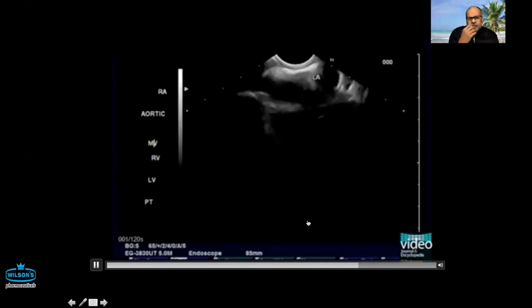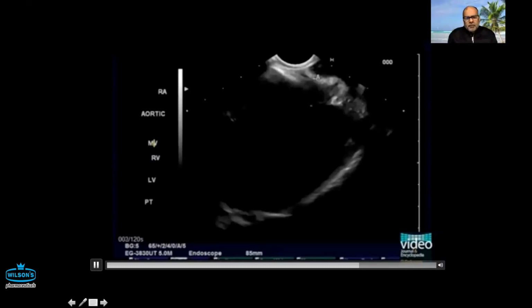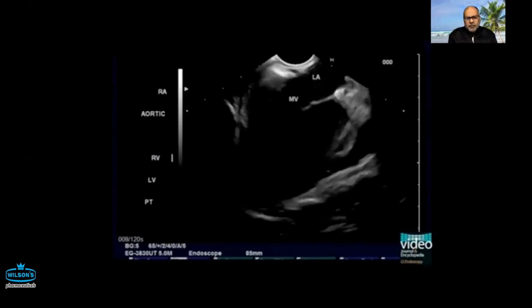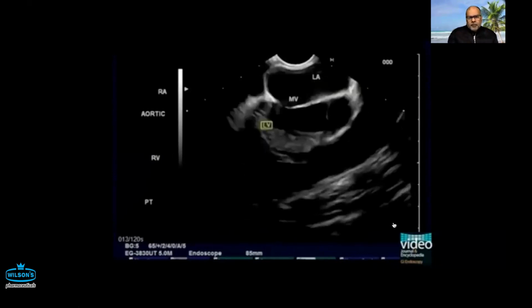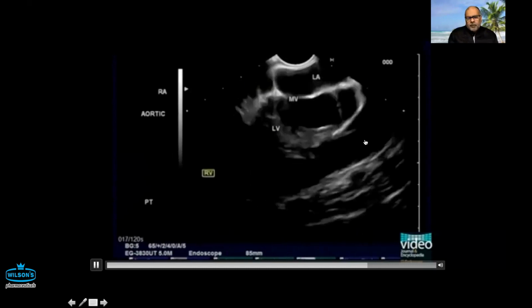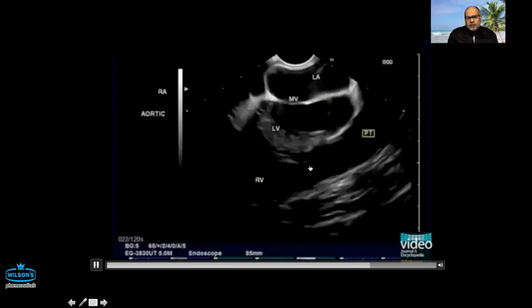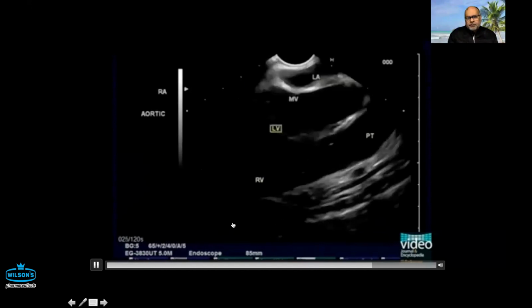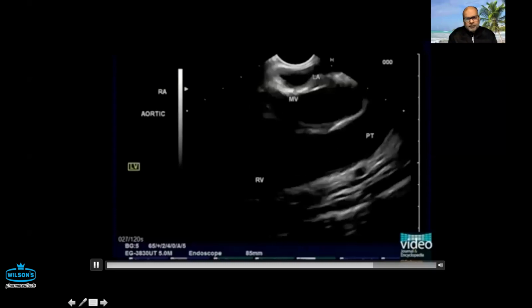This video shows the mediastinal structures at the level of the left atrium. Once the left atrium is visualized, generally clockwise rotation with slight manipulation shows the right ventricular outflow tract, and slight anti-clockwise rotation shows the left ventricular outflow tract. If clockwise rotation is done slowly along the left atrium, it brings the mitral valve into view. Beyond the mitral valve, the left ventricle is seen. The left ventricle can be followed up to the aortic root, slightly proximal to the mitral valve.